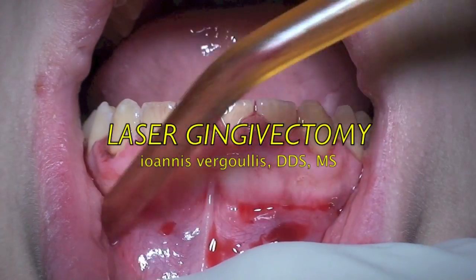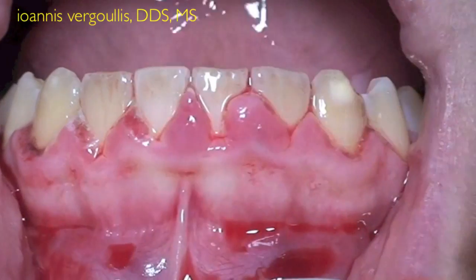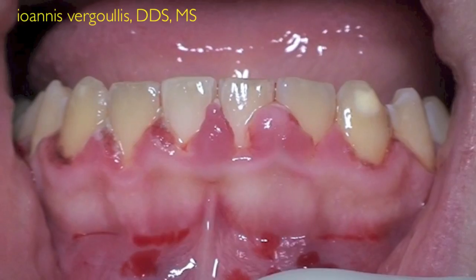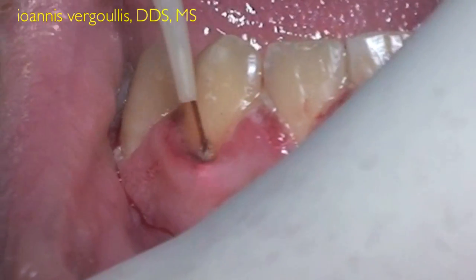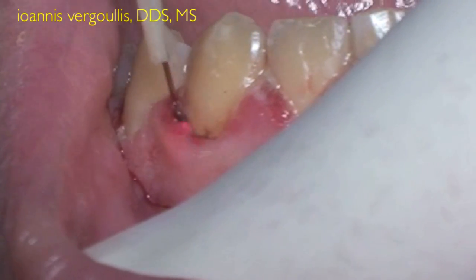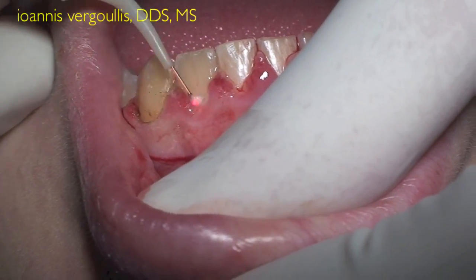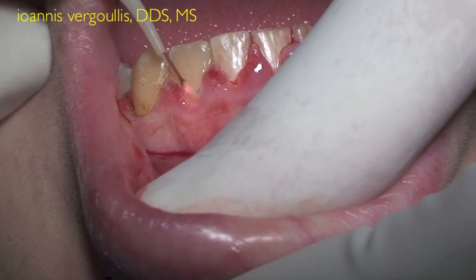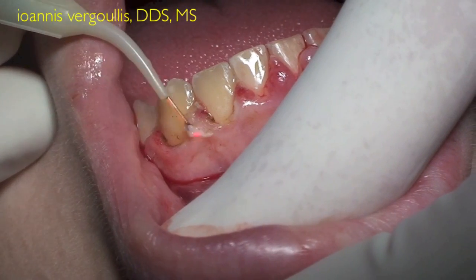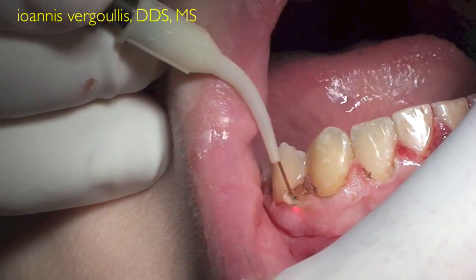This case was presented in our clinic post-orthodontic treatment. The diagnosis was gingival hypertrophy in combination with altered active eruption. Although we explained to the patient that in order to fully expose the crowns of the teeth, we will need to do gingivectomy in combination with ostectomy and osteoplasty, the patient declined from having an osseous surgery. So we decided to proceed with just the gingivectomy and the gingivoplasty.